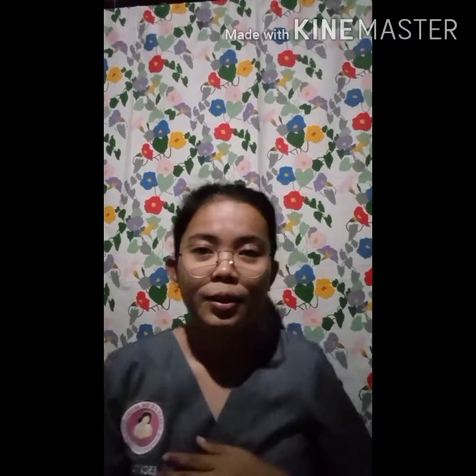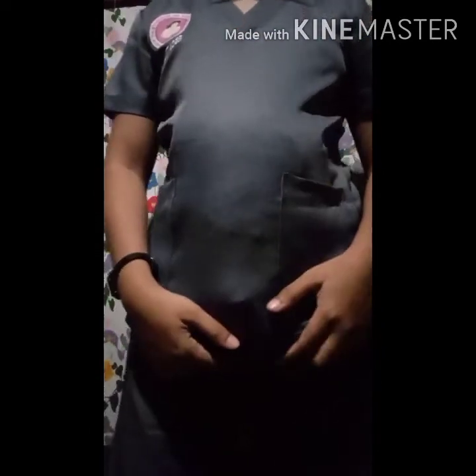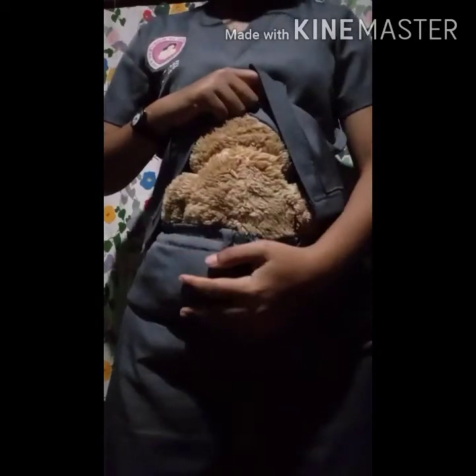Once we are done informing her, we will do the measuring of the fundal height. I assume that I am the client, and in order to have a bulged abdomen, I put a teddy bear inside my uniform. Here, we will hold the zero mark of our tape measure and put it above our symphysis pubis.